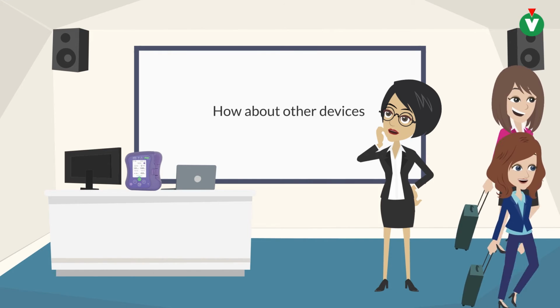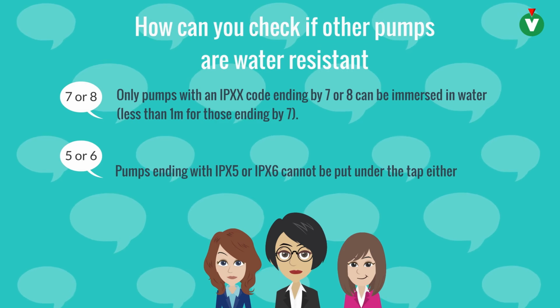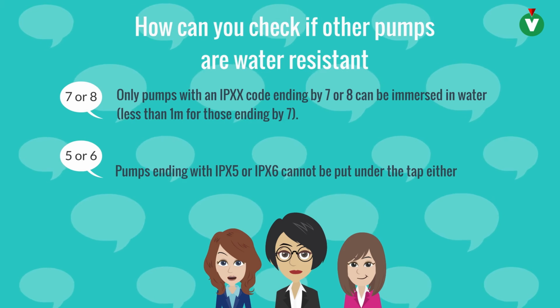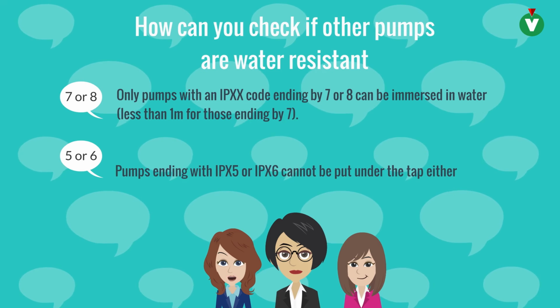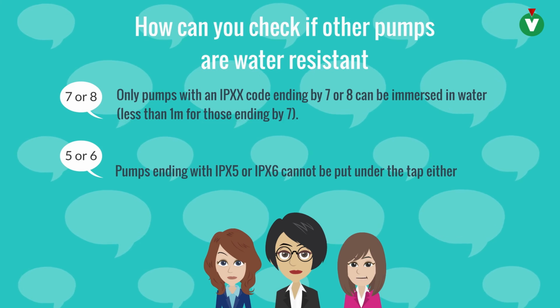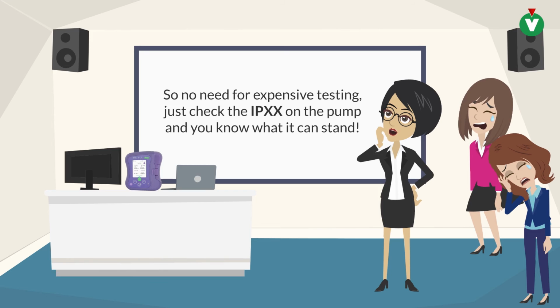How about other devices? How can you check if other pumps are water resistant? Only pumps with an IPXX code ending by 7 or 8 can be immersed in water. Pumps ending with IPX5 or IPX6 cannot be put under the tap either. So no need for expensive testing, just check the IPXX on the pump and you know what it can stand.